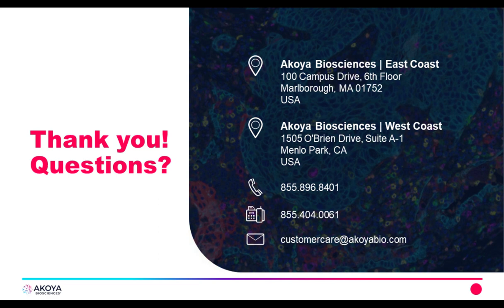Thank you, Dr. Saunders. Can the images be exported, and could they be used in other software platforms for analysis, like ImageJ or similar? I can take this question, and the answer is simply yes. They're just TIFF images that are produced, so you can use them with any third-party or alternative image analysis software that you'd like to use.